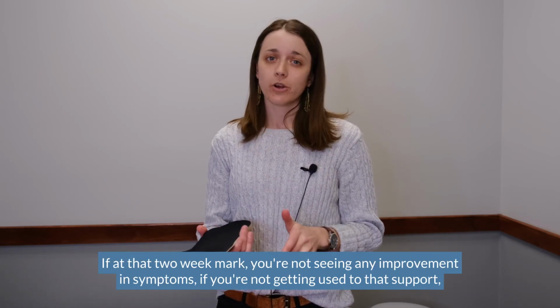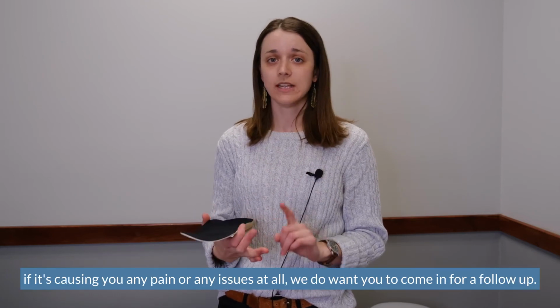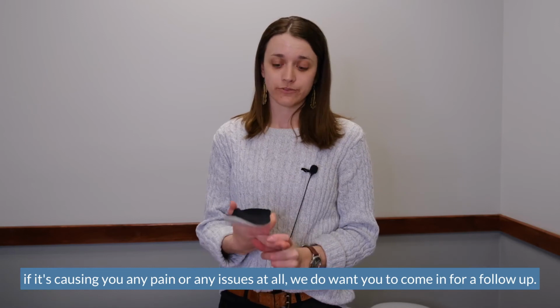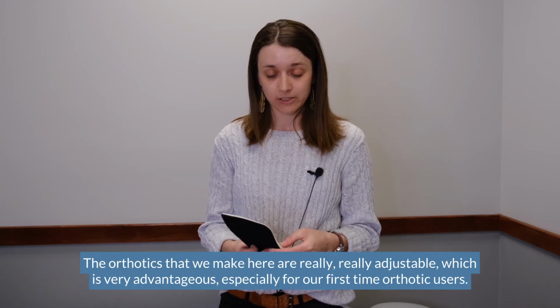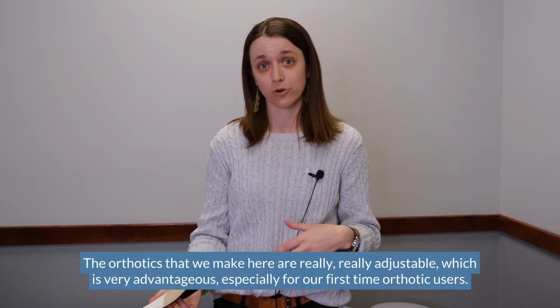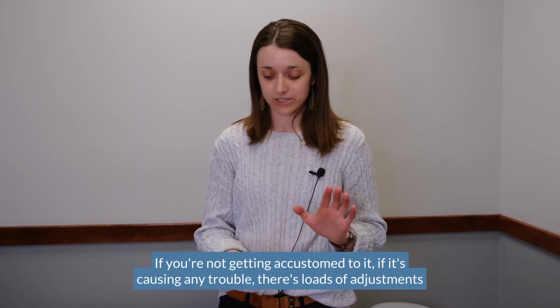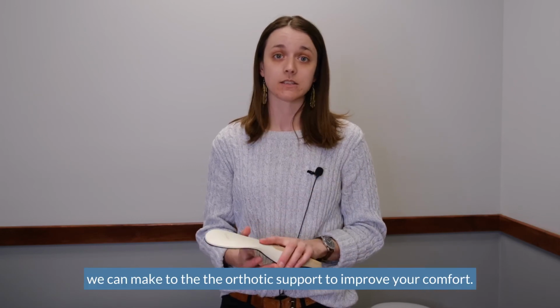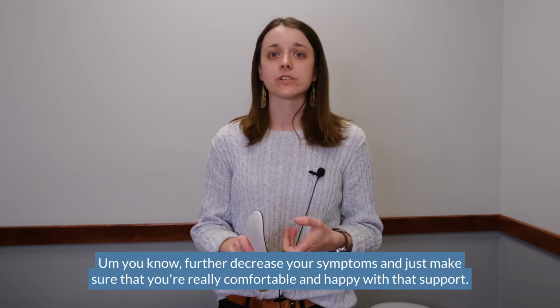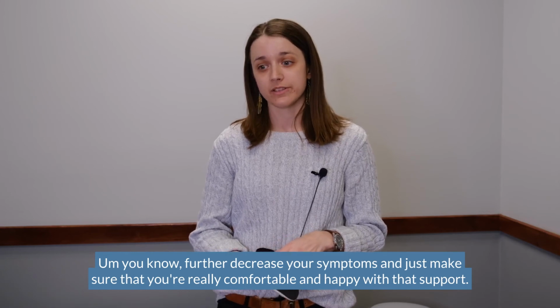If at that 2-week mark you're not seeing any improvement in symptoms, if you're not getting used to that support, if it's causing you any pain or any issues at all, we do want you to come in for a follow-up. The orthotics that we make here are really, really adjustable, which is very advantageous, especially for our first-time orthotic users. If you're not getting accustomed to it, if it's causing you any trouble, there's loads of adjustments we can make to the orthotic support to improve your comfort, further decrease your symptoms, and just make sure that you're really comfortable and happy with that support.